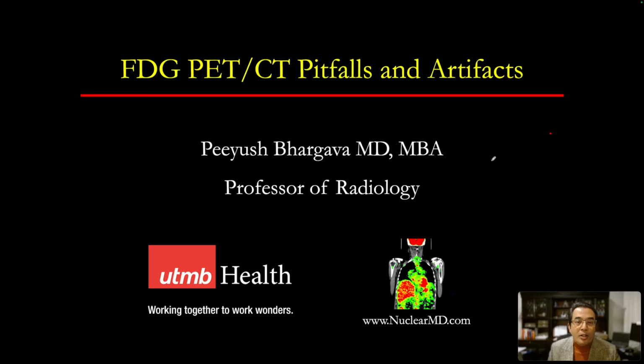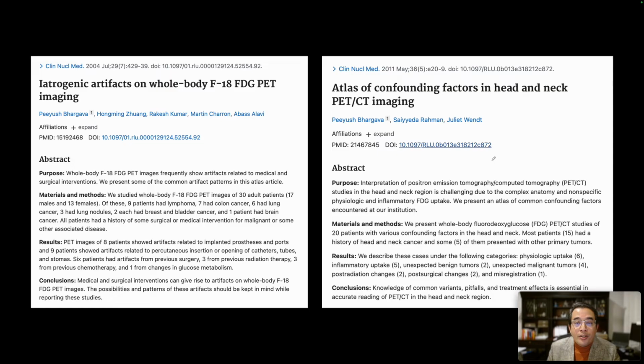Hi, this is Dr. Bhargava, and this short video is about pitfalls and artifacts on FDG PET-CT imaging. Here are a couple of articles that I've published in the past on the related topic.